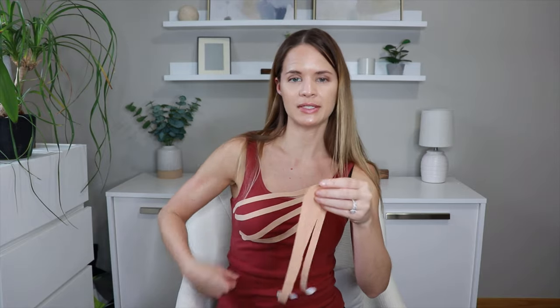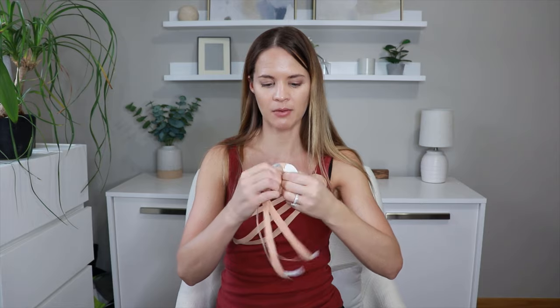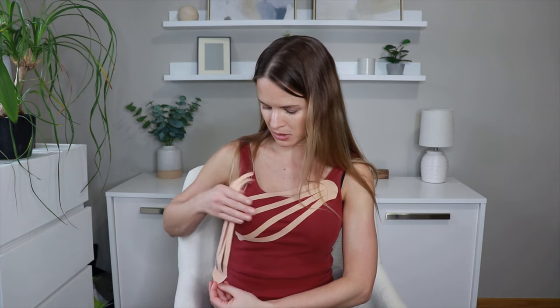If someone's swelling is actually in their arm or they're just trying to get the lymphatics going, these strips should go straight across towards the other armpit. However, if we're talking about breast swelling, we really want to cover the breast and get the fluid moving across — that's why I went down a little bit. That's also the difference between this and other pictures online where you see it go straight across. For the second strip on the side, same thing — rip back the paper from the anchor end and place it at least to the level of the belly button or just past it, positioned on the side of the body.